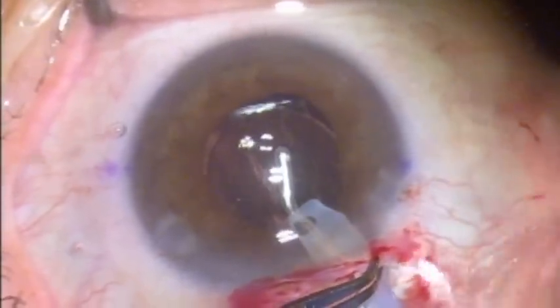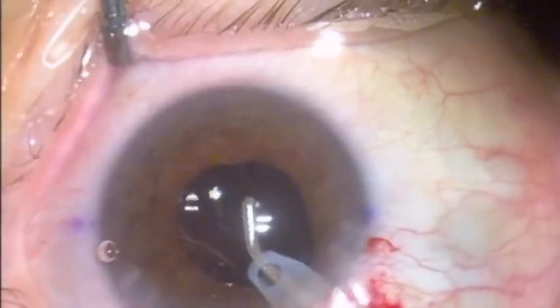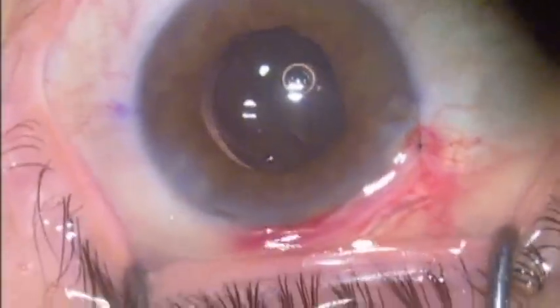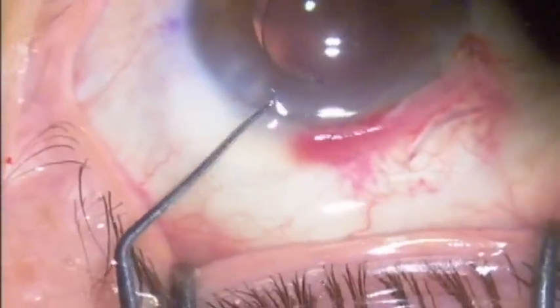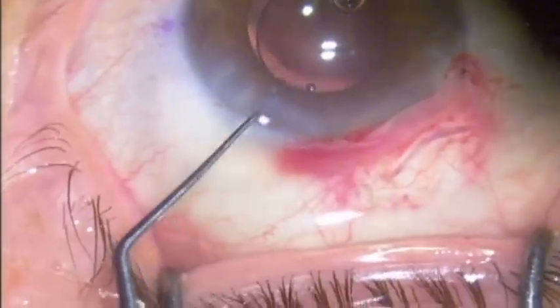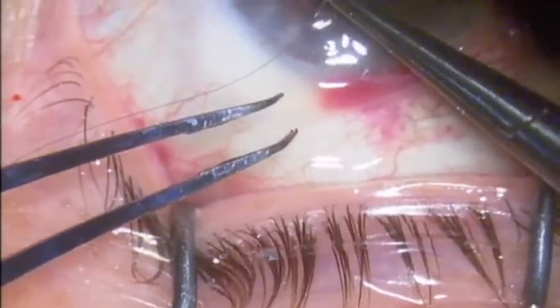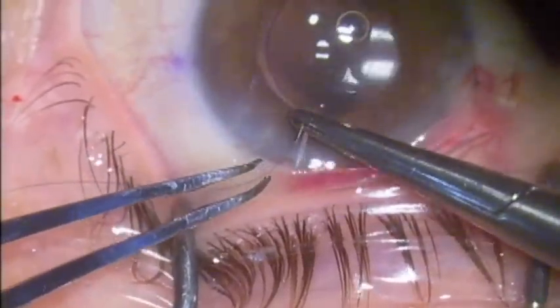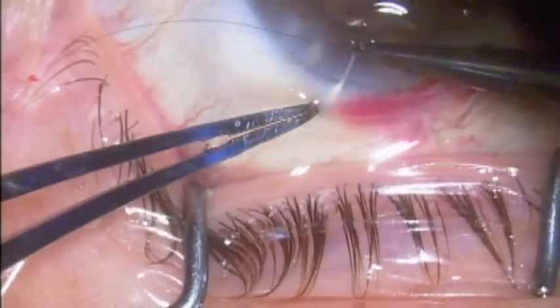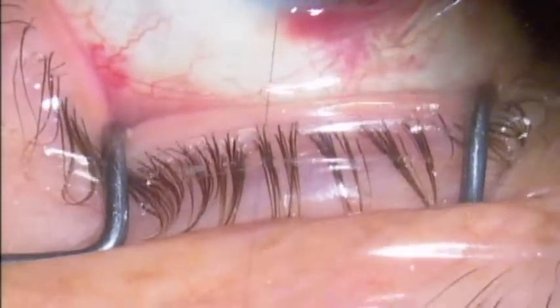I'm going to remove the residual viscoelastic. After doing this, I've made a decision to reconstruct the original cataract surgeon's clear cornea wound. This clear cornea wound was placed superiorly and it was inducing some flattening, which was exaggerating the patient's astigmatism. In addition to the scleral tunnel incision on the steep axis, I would reconstruct this clear cornea incision to reduce the flattening effect and the exaggeration of astigmatism.